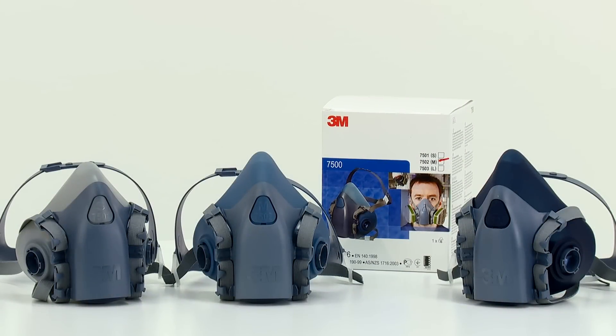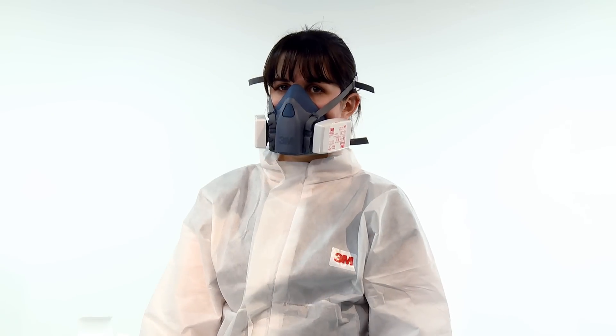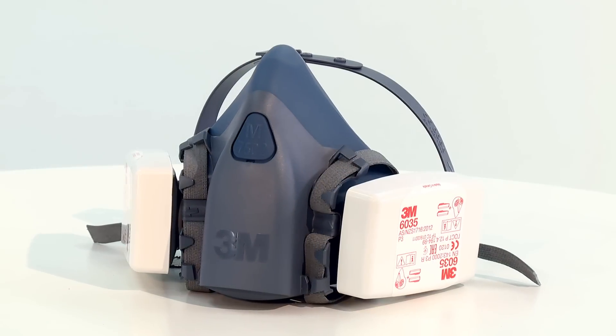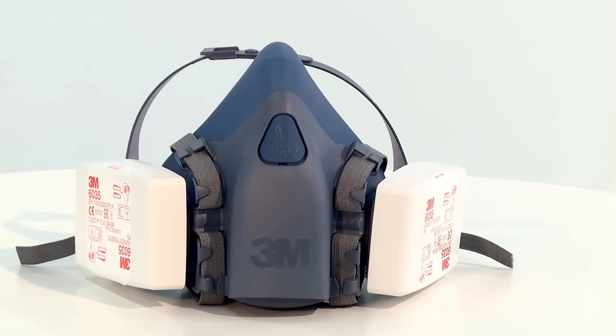Hello and welcome to this video demonstration of how to correctly fit the 3M 7500 series reusable respirator. Jen will now demonstrate how to fit the medium 7502 respirator. The procedure also covers the 7501 small and 7503 large models.